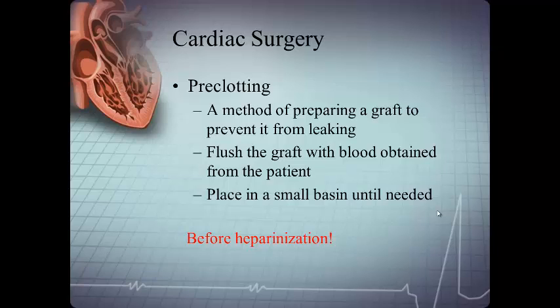Should you have to perform pre-clotting, the big thing to remember is to use non-heparinized patient blood, flush the graft with said blood, and then place in a small basin until needed.